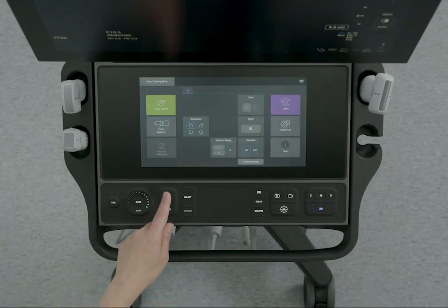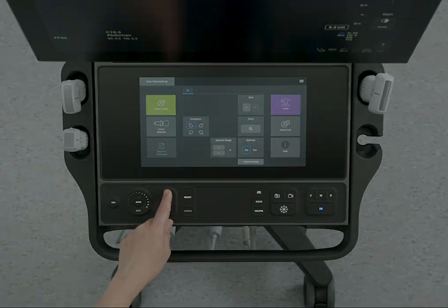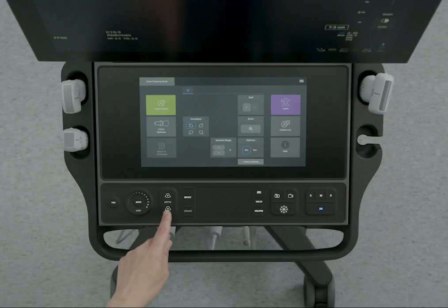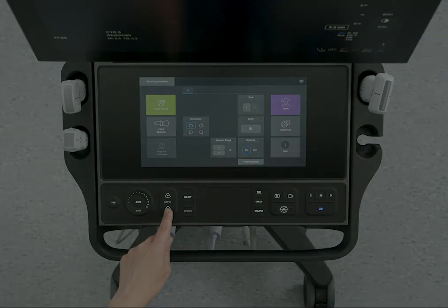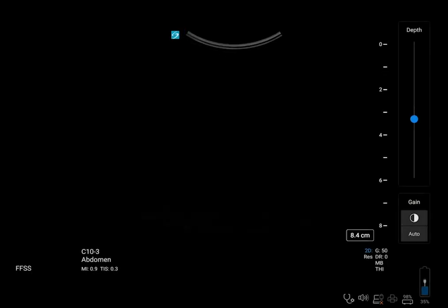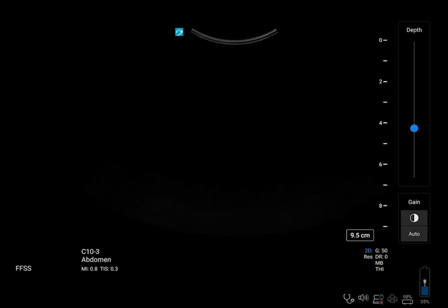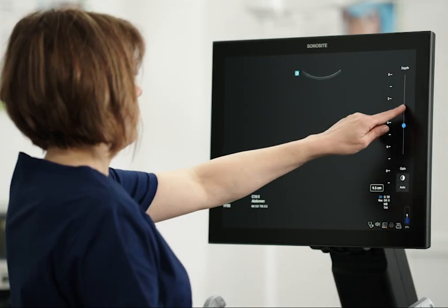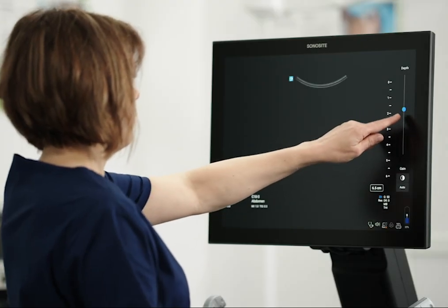Press the Upper Depth control to decrease the displayed depth, or press the Lower Depth control to increase the displayed depth. You can also adjust depth on the clinical monitor.